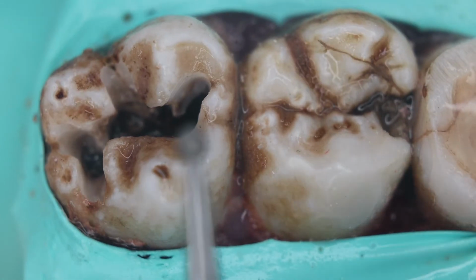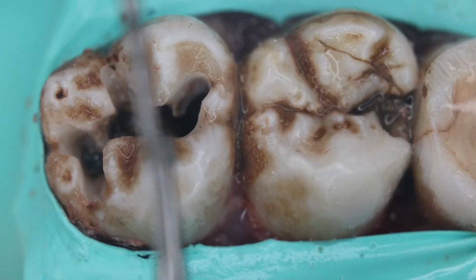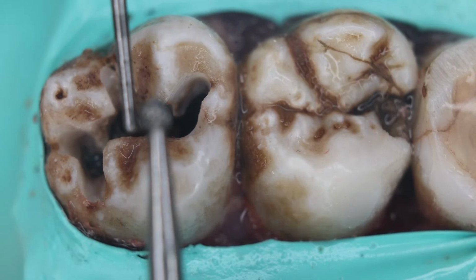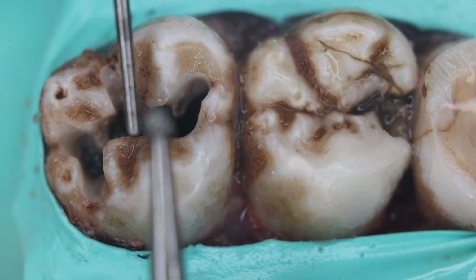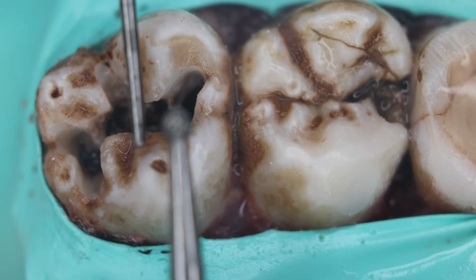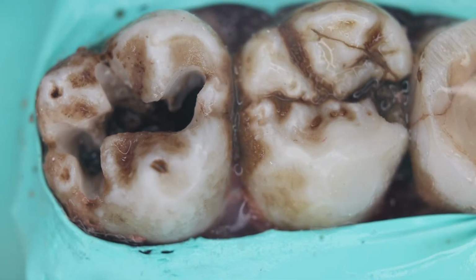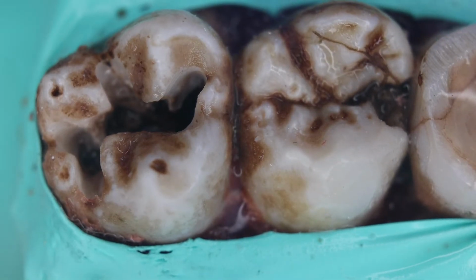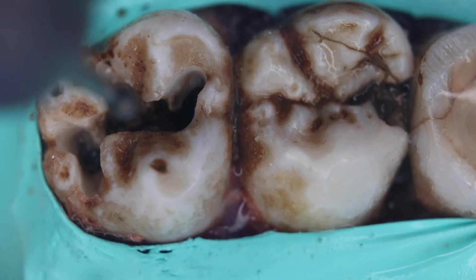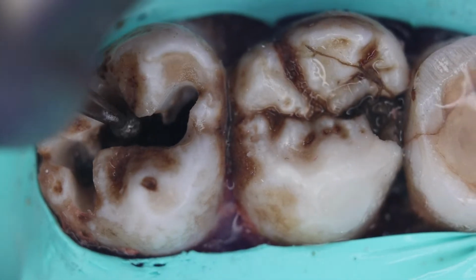So here we have this big round burr, and when we see the depth of this big round burr, it is roughly 1.5 millimeters. So we can get inside the dentine, covering the enamel that we had already explored, and we can remove the caries with the help of this burr, going deep up to the neck.